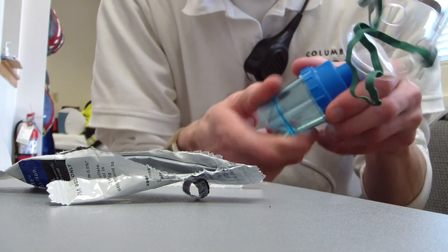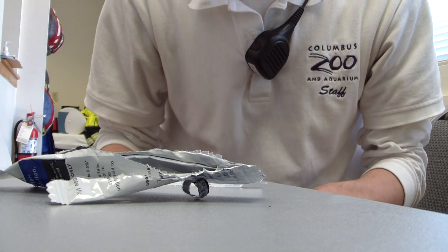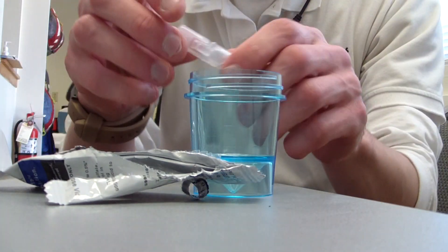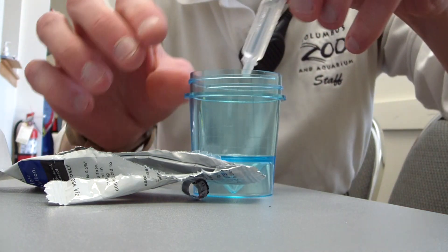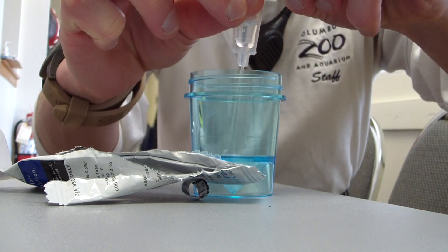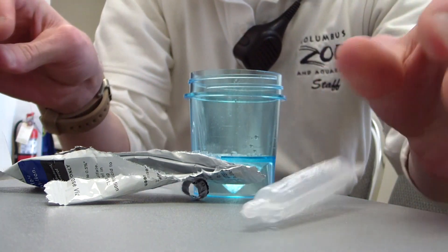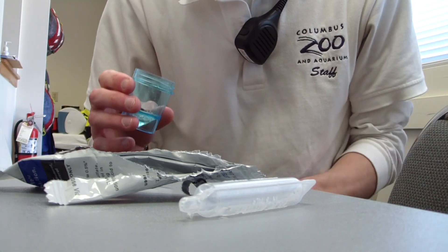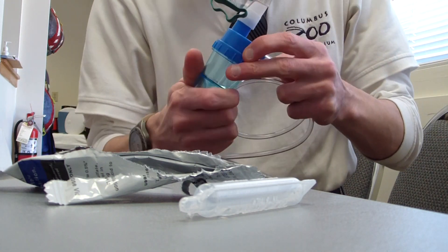What I want to do is unscrew the base here — I'm trying to maintain some level of sterility. Pop the cap off of this albuterol. Now dump the entire contents. If your unit calls for it, screw it back in as such.